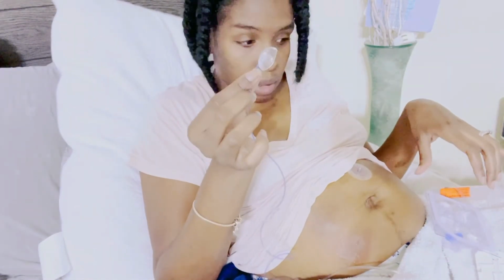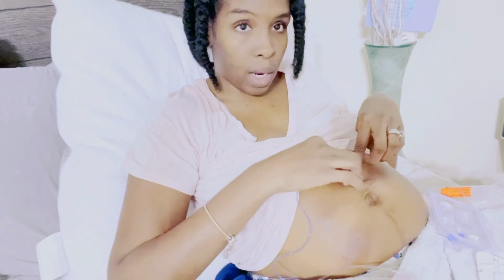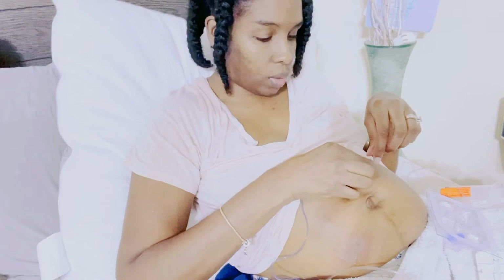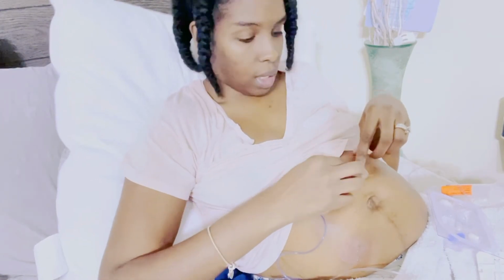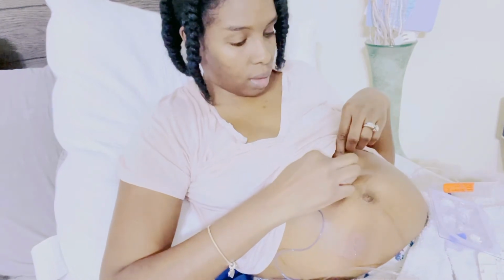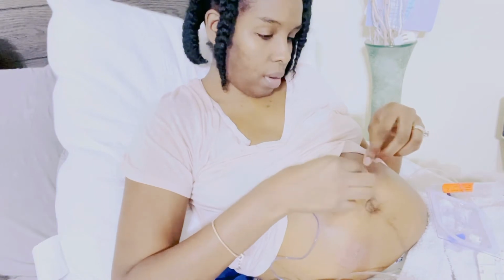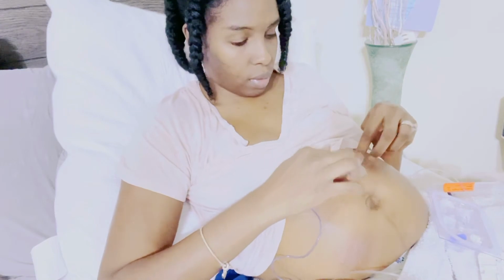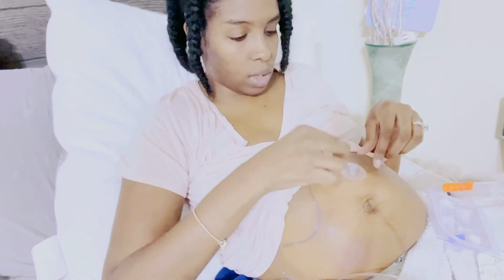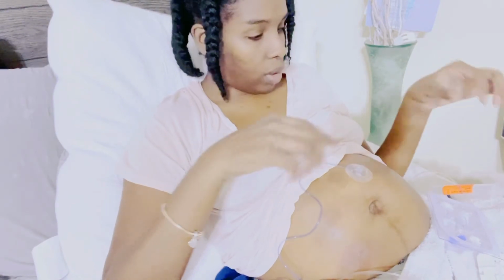Yep, it's there. So now I just take this little piece here and connect it. You heard it clamp twice. Here, let's do it again. Because you have to clamp this. You have to hear it twice. All right. So you heard it clamp twice. So now you tug on it to make sure it's on there tight. It's on there pretty tight.